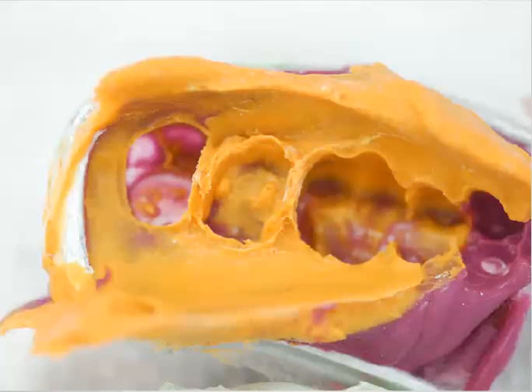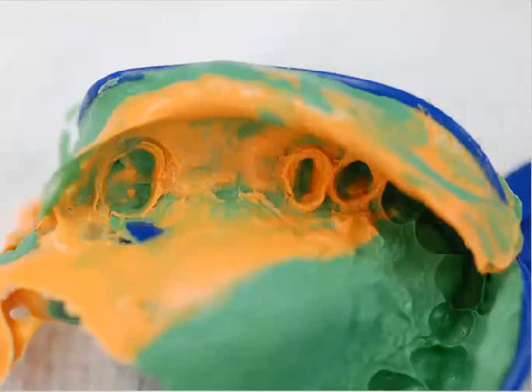You can see one of the issues here. We have torn margins, incomplete margination. Perhaps there's a problem of inadequate tissue distension, not getting the material down into the sulcus. It's really impossible to fabricate an adequately fitting restoration. We have situations here. This is a triple tray. I don't even know how you can get all this material in at once, opposing the surface you're trying to impression. But you can see we have problems here with the burn through, right in through here in different areas.